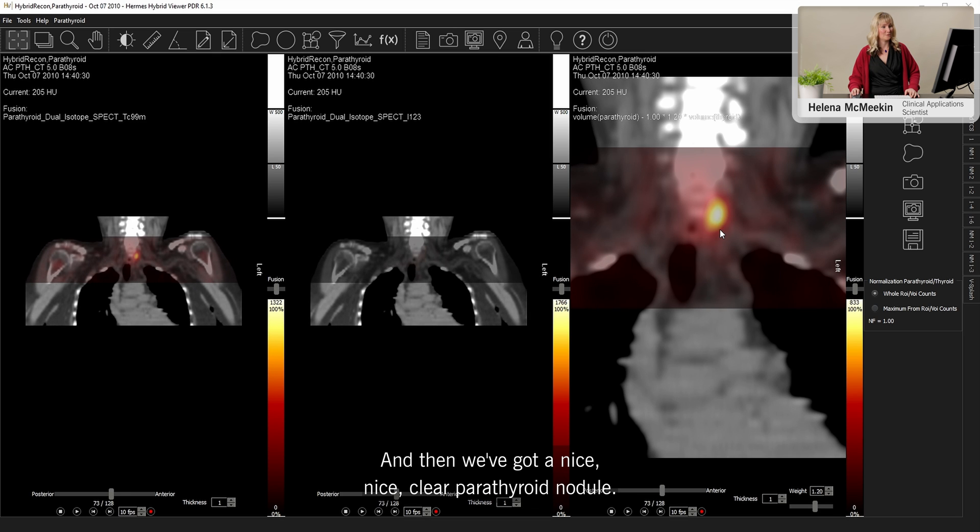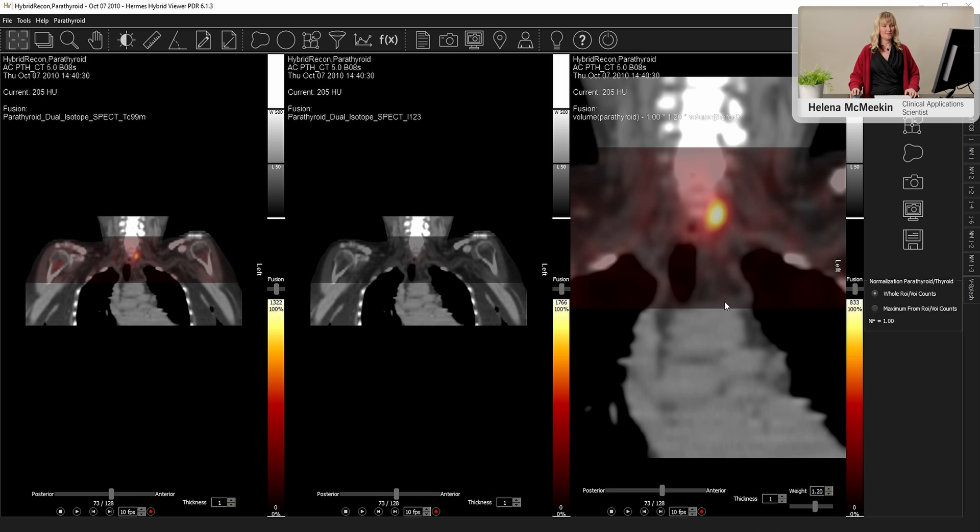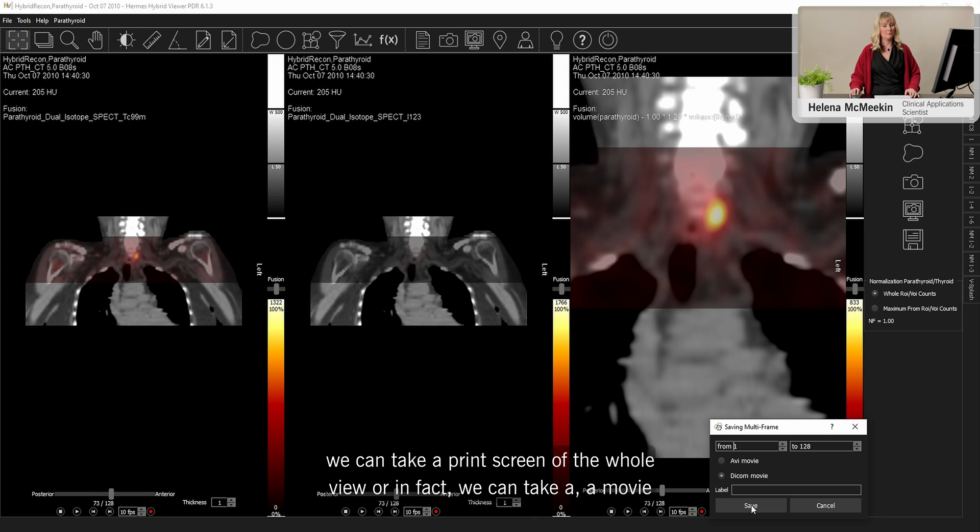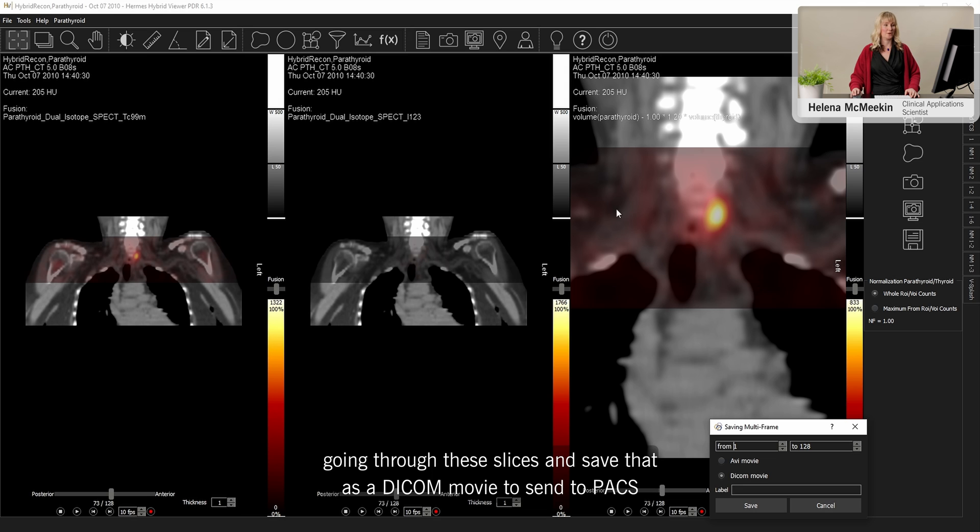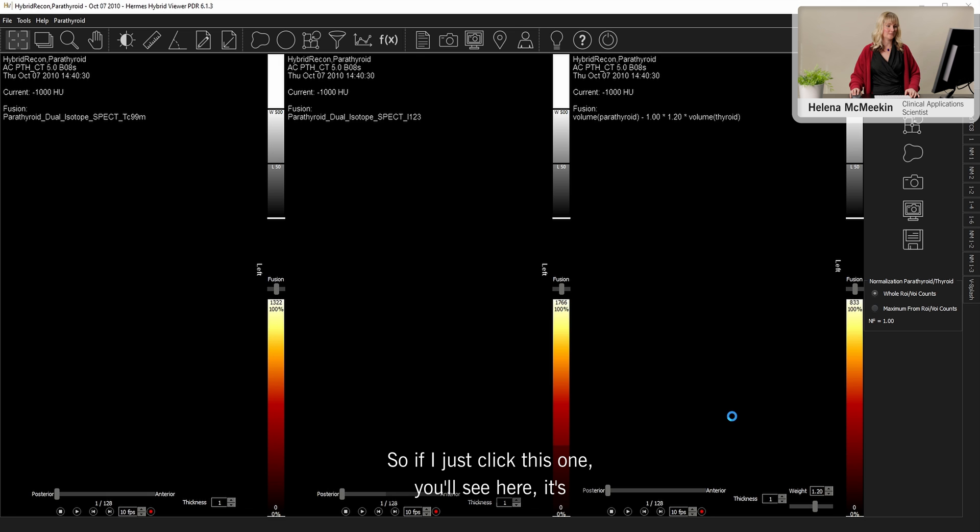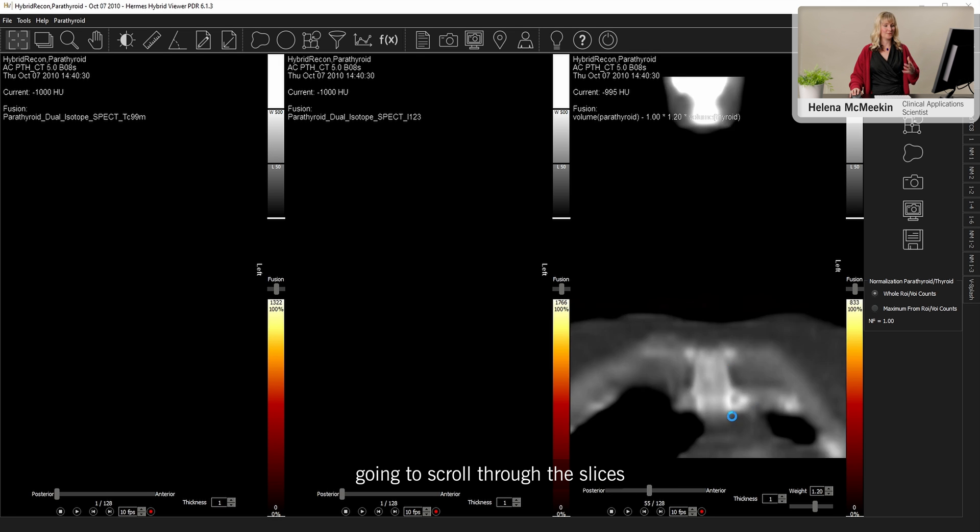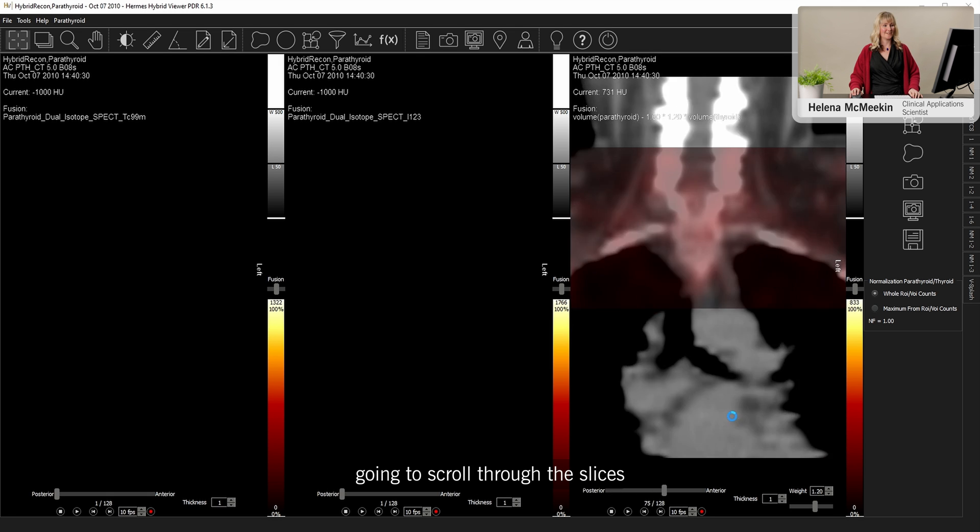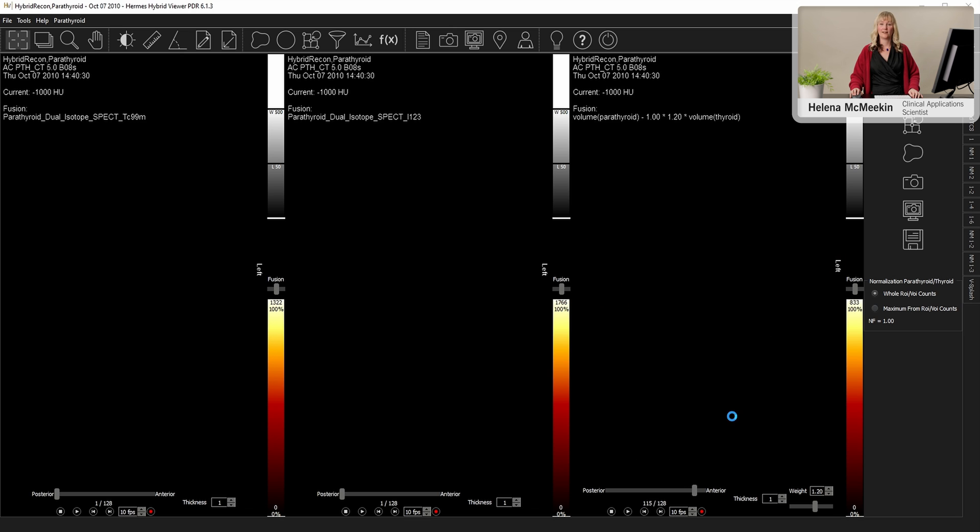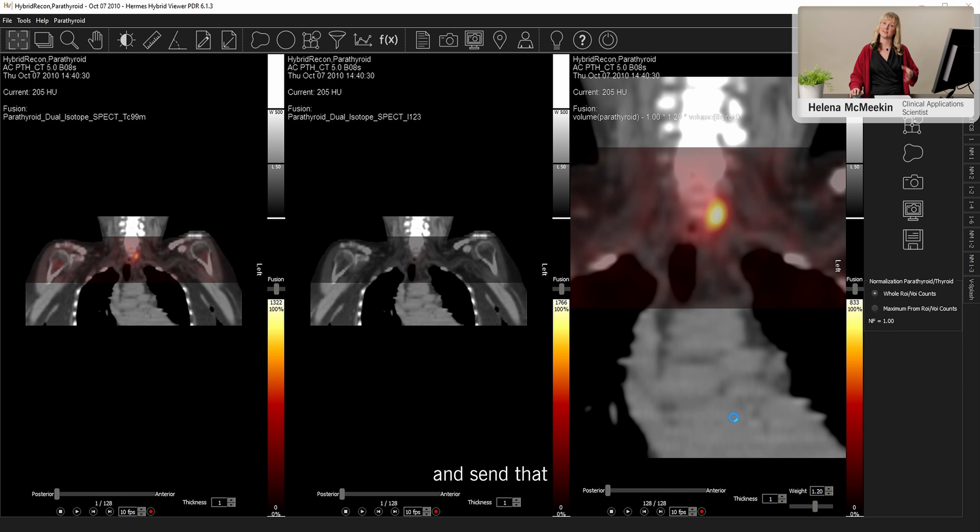So you can adjust this until you're happy. And then we've got a nice clear parathyroid nodule. And then if you'd like, we can take a print screen of the whole view. Or in fact, we can take a movie going through these slices and save that as a DICOM movie to send to PACS. So if I just click this one, you'll see here that it's going to scroll through the slices and send that then as a movie to PACS.